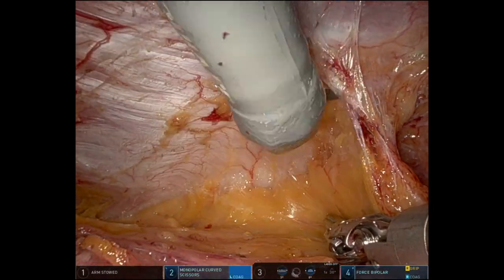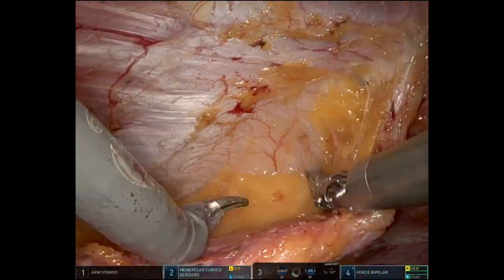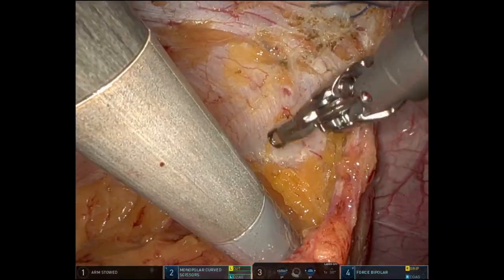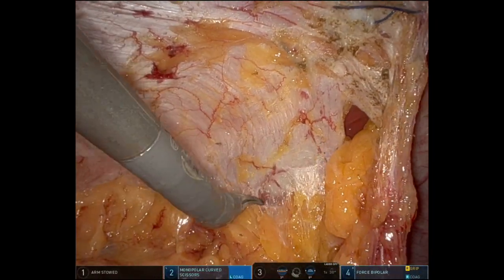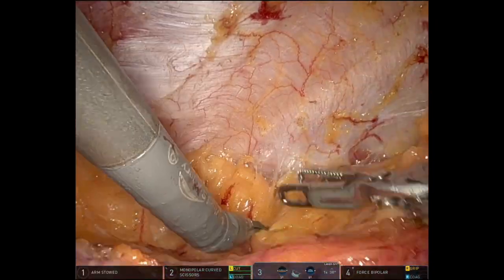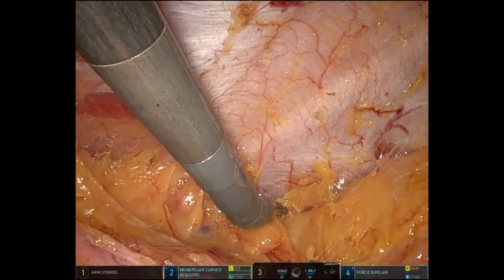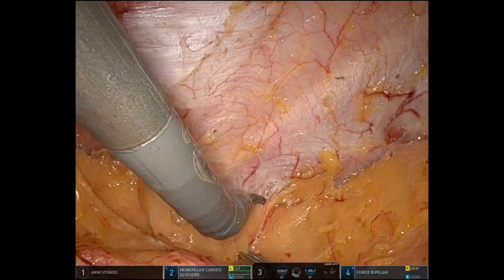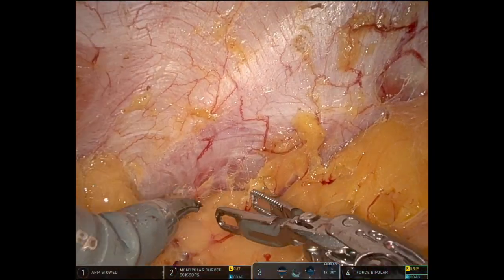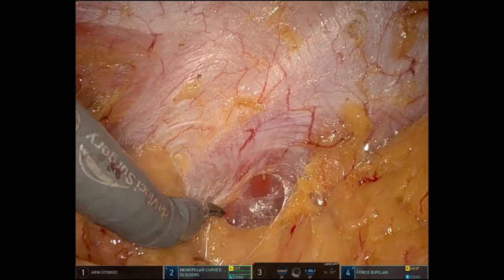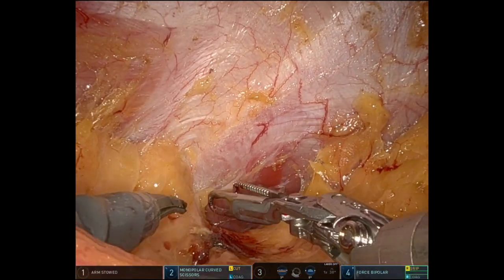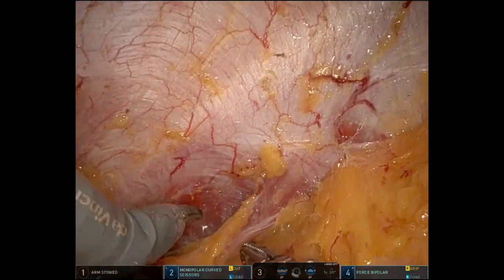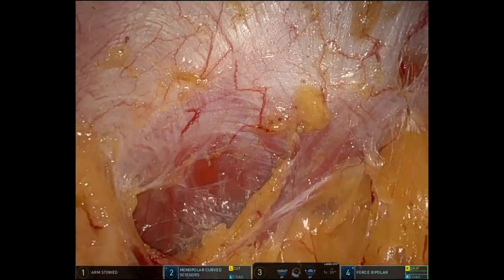Here I am dropping down the falciform, developing the preperitoneal space cranially, which is like a virgin plane. I thought it would be easier to develop the preperitoneal space without any problem. You can see the linea alba on the superior section of the screen, and inferiorly the dropped-down falciform with the peritoneum — that's the xiphoid process. And now I can start seeing the diaphragmatic fibers, the costal margins of the diaphragmatic fibers.